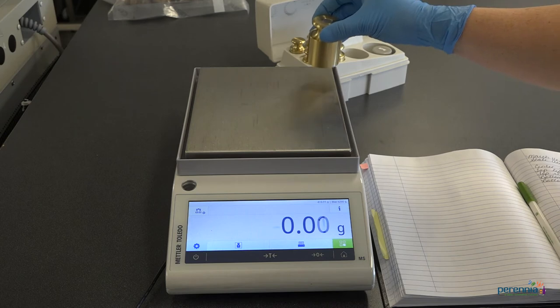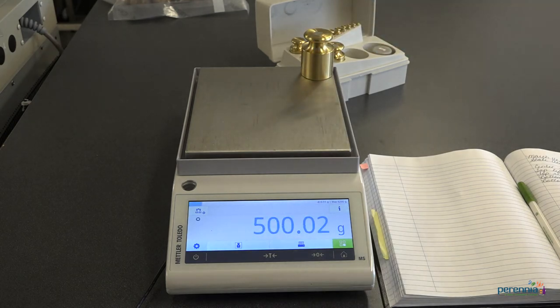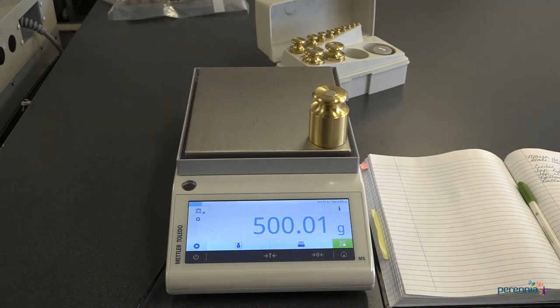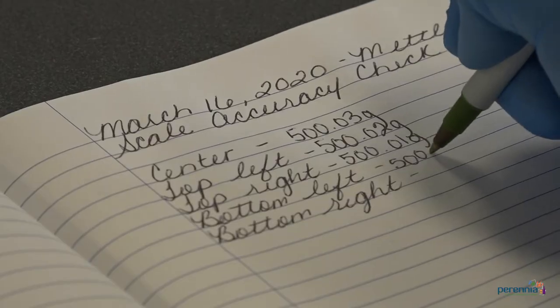Step 4: repeat but this time place the known test weights in each corner of the scale. Record findings.